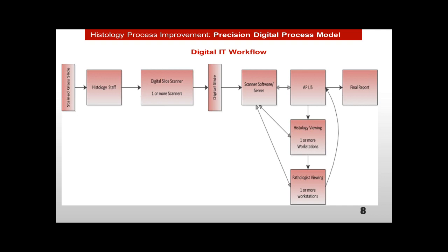Now that we created all of that work to pull things together and put them into the digital scanning process, I say that it needs to come back out into histology again, and there needs to be some review of it, making sure that we have the correct information, that we may not have to rescan, that we may have to pull more information from the different servers and reporting software before it then gets to the pathologist.